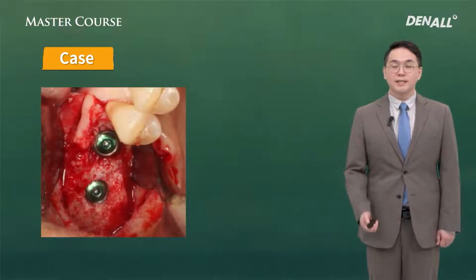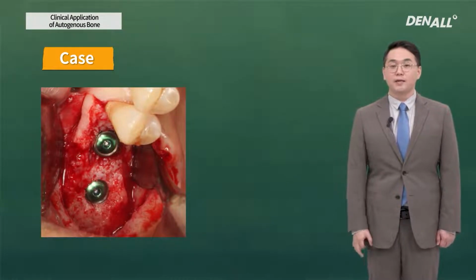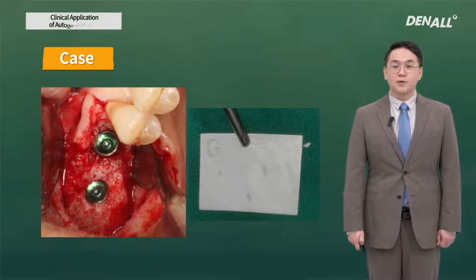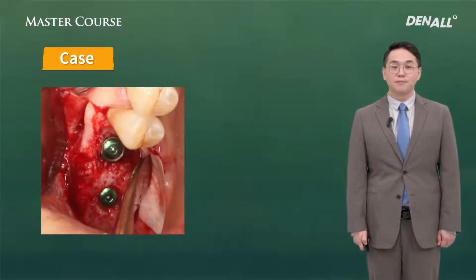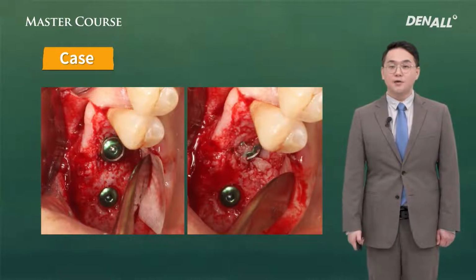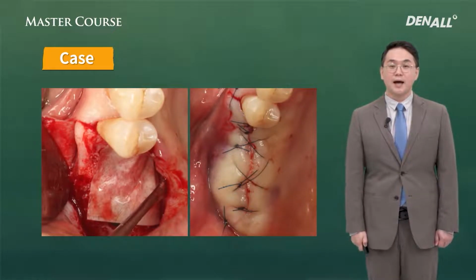As we expected on the CT, the palatal side of the number 16 implant showed the bone defect. The palatal side is exposed. We decided to do GBR using membrane and bone graft material. The membrane is positioned, and below the membrane, on the palatal bone defect, the harvested autogenous bone particulates are put. The bone graft material is covered with a membrane and primary closure.